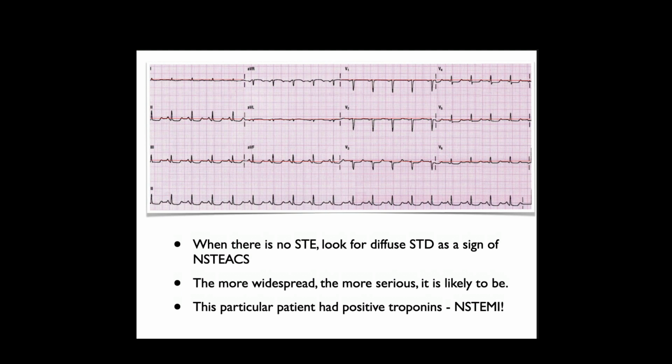Yeah, maybe. This patient was taken in. This is a 12 lead. The patient has the history and clinical presentation of somebody with acute coronary syndrome. They have a 12 lead that suggests non-ST elevation ACS. So they were transported into the hospital, tested for troponins. Yes, they were there. This patient had an NSTEMI. Okay?